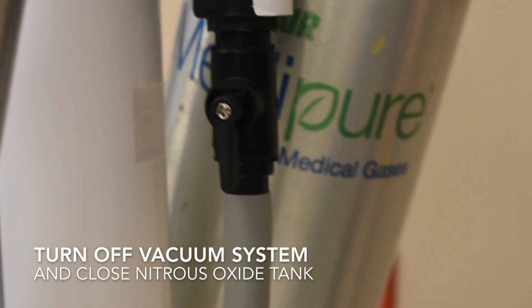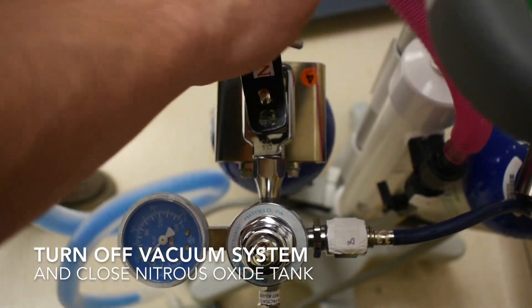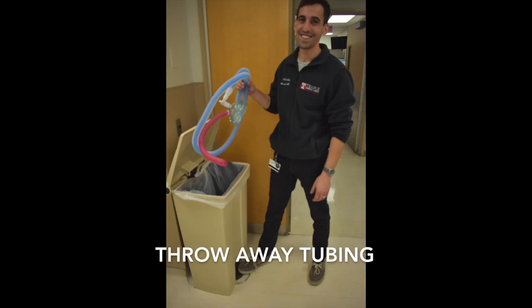When finished, turn off the vacuum system and close the nitrous tank by turning the key clockwise. Reset the nitrous gauge by flushing the system — the gauge should read 0 psi after flushing. Throw away the tubing, disconnect from the wall, and return the nitrous machine to the trauma bay.